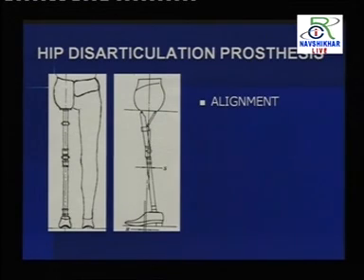Normally the hip joint placement is at the level of the greater trochanter, but here you have to take it anterior to this. We have to keep an anterior hip joint placement. The knee is posterior to the hip-knee-ankle line, but that is from the stability point of view. So all these precautions we have to take.